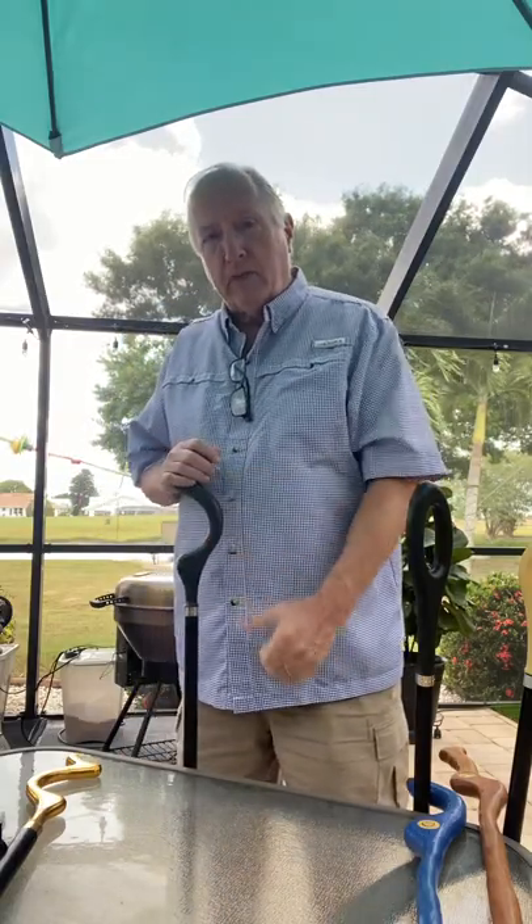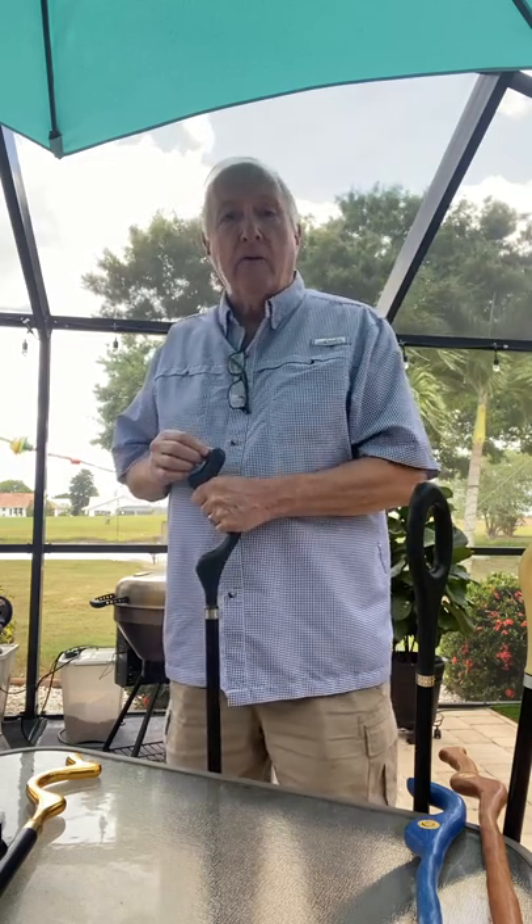What we found out over a period of years was this transition going from a regular cane: the minute you change the grip to horizontal or slightly forward with your wrist slightly forward, and you push down on that, you find that it takes pressure off your wrist and off your shoulder.